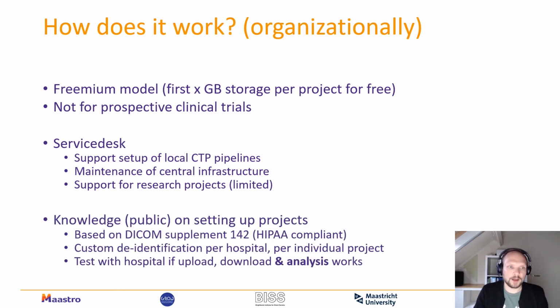Furthermore, to dive a little more in depth regarding the CTP part and the de-identification, the pipeline we use to de-identify the images is based on DICOM supplement 142, which is basically the HIPAA compliant version of which DICOM metadata elements should or shouldn't be stored. Per project, we deviate from that HIPAA compliant supplement, mainly because, for example, with a PET-CT scan, we need the weight of the patient, which is in the DICOM metadata.